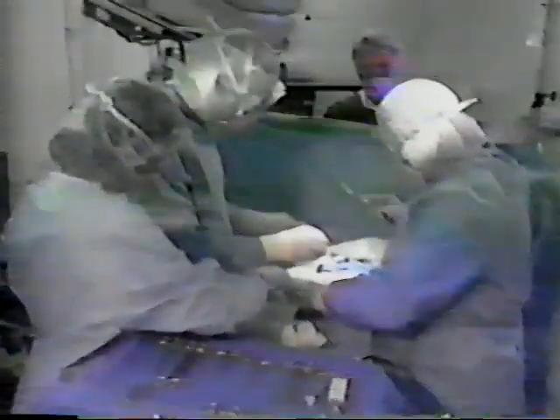The surgical team must observe precautions to avoid contamination and maintain the sterile field. The hands should be kept above the waist and in sight at all times. The sterile areas are the front of the gown from the table level or sterile field to 2 inches below the neck, the sleeves from 2 inches above the elbow to the cuff, and the surgical gloves. If any part of the sterile attire becomes contaminated, immediate corrective steps must be taken. For instance, if a glove becomes contaminated or perforated during surgery, it must be changed immediately.